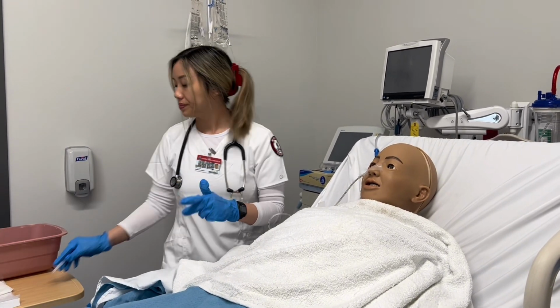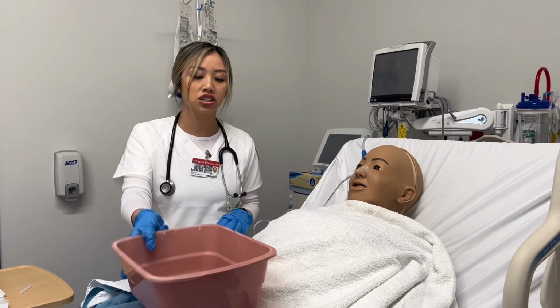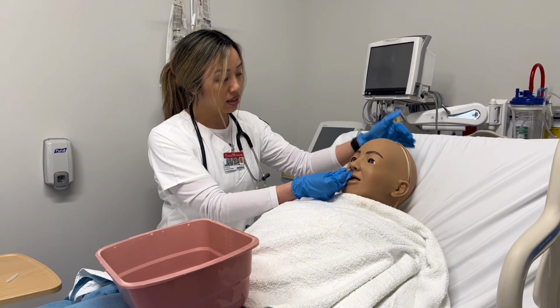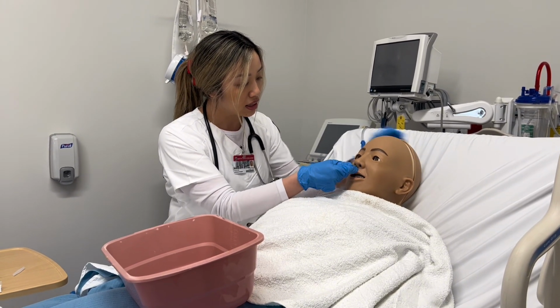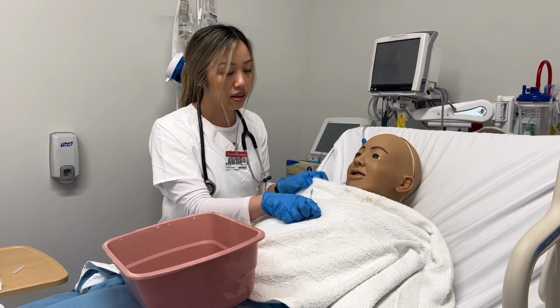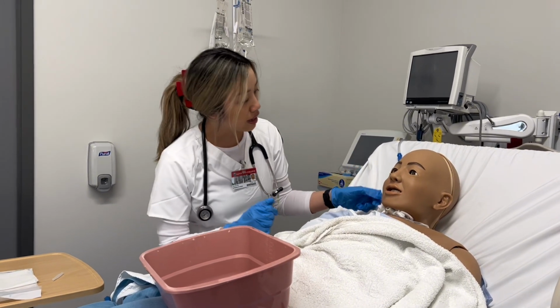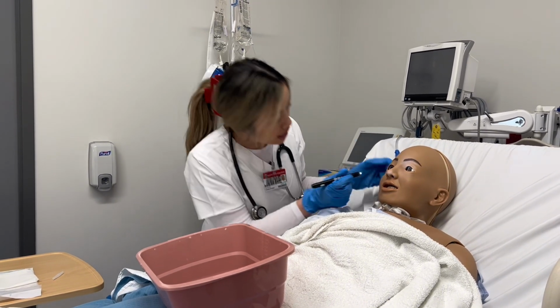All right. Okay, so I have this towel here. This is just in case we need it. And then on my count, okay? Ready? Take a deep breath. 1, 2, 3. And I'm gonna go ahead and coil it, coil it, coil it. Okay. So this is good. This is ready to go down here. And then I'm gonna go ahead and assess his nares. So I'm gonna go ahead and assess it.